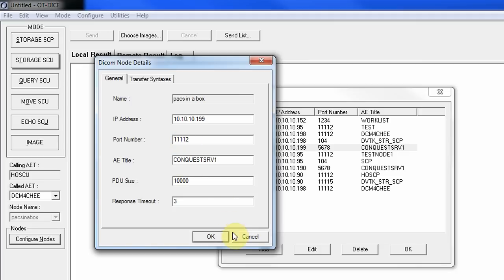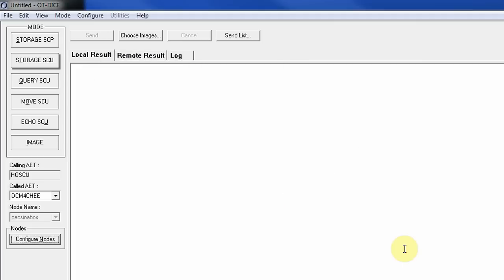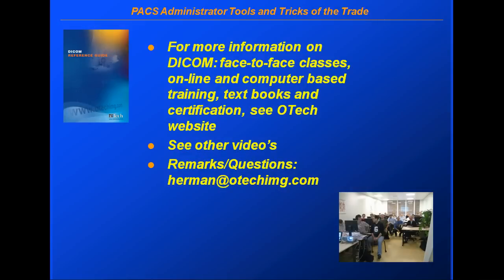Once everything is configured, we're done. As you can see, it's relatively easy to set up a DICOM modality. To recap: make sure you have unique AE titles, set up your calling and called AE titles and the AE titles of the devices you want to communicate with, make sure IP addresses are correct, AE titles are unique, and use port number 11112.